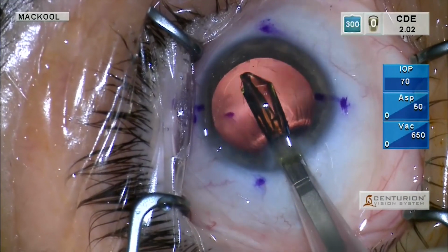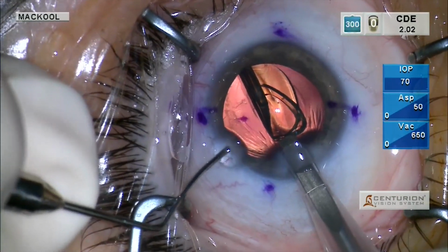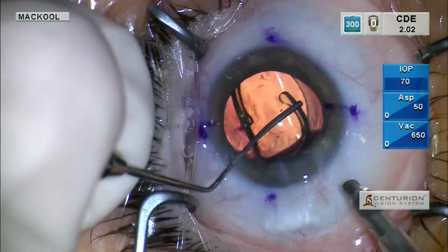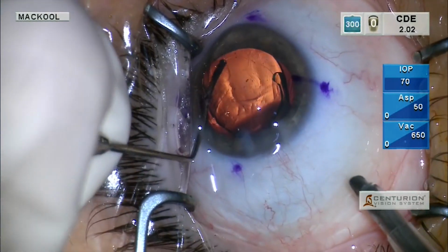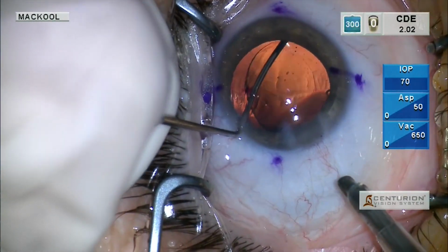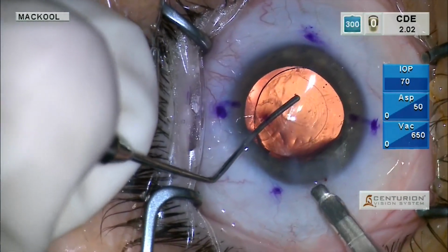And now we inject the intraocular lens directly into the capsular sac. We use the spatula that I was palming in my left hand to insert the IOL into the sac fully before it fully opens. That makes it easier to do that. And then typically, we know that these three marks are the axis that we want the IOL to be aligned with. We use that haptic optic junction to rotate the intraocular lens.